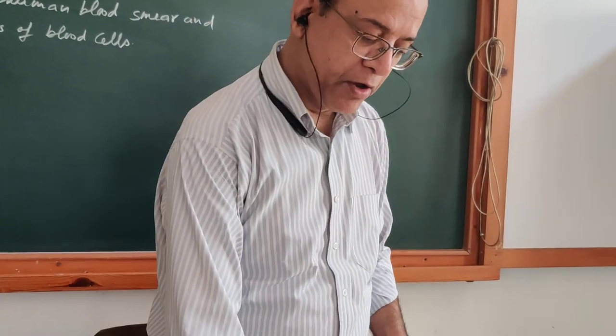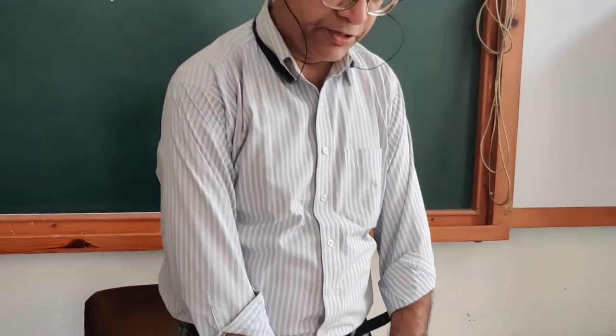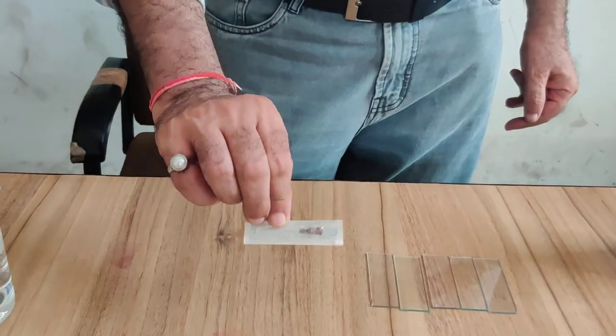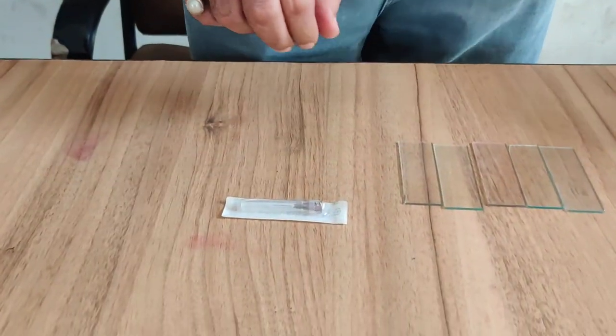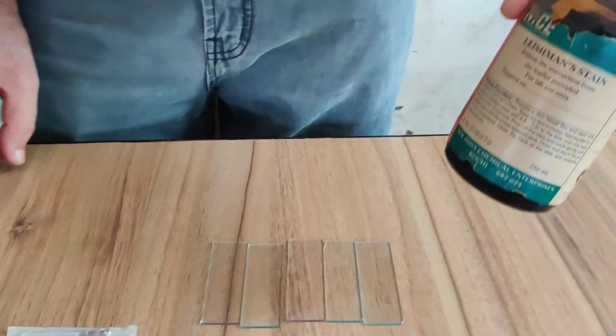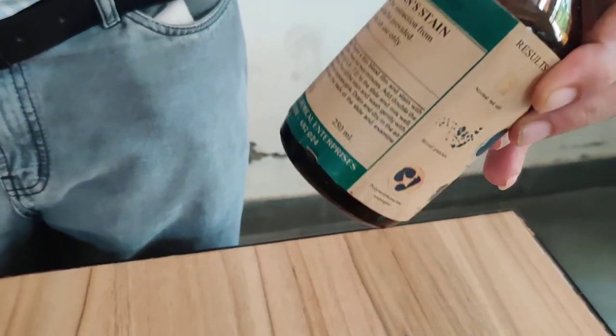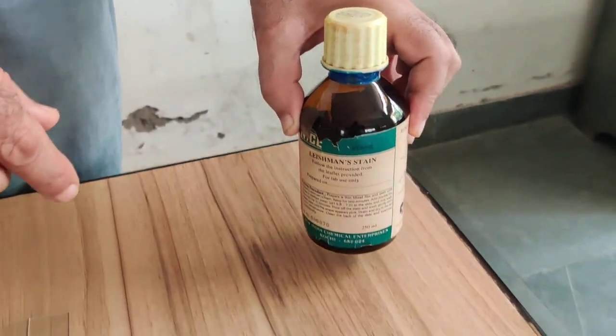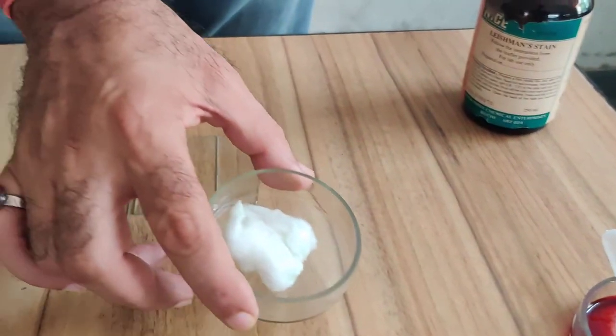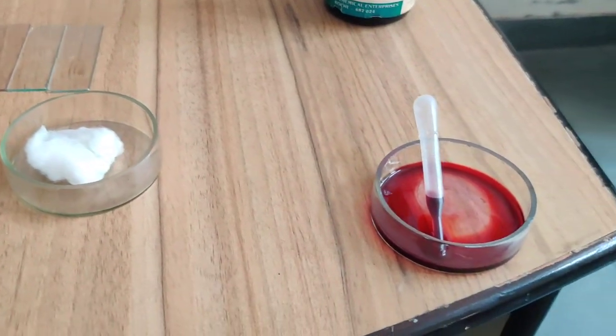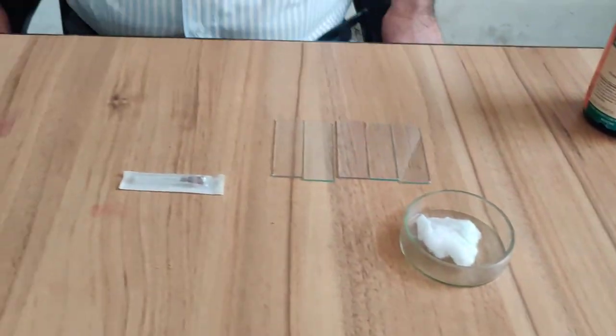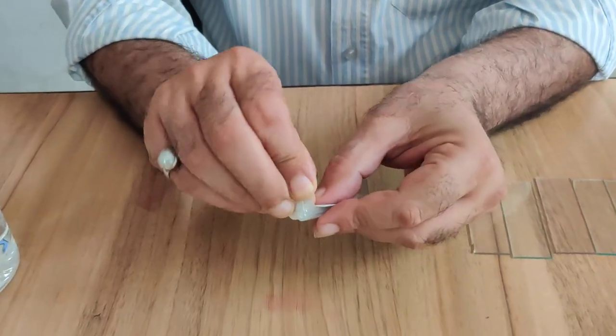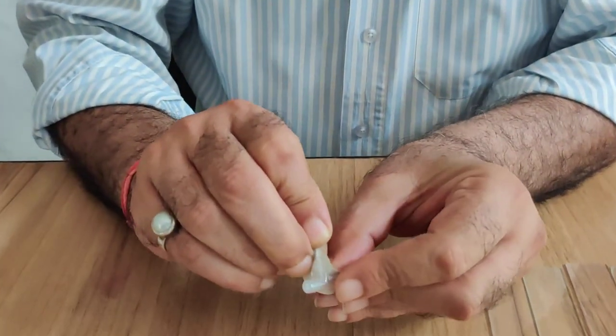For the preparation of this slide of blood smear blood film, we need some slides, this is a needle, a sterilized needle. This one is Leishman's solution. I have taken some solution here. Cotton. You will spread, do it carefully because you have to pierce your finger. So first take out the needle.